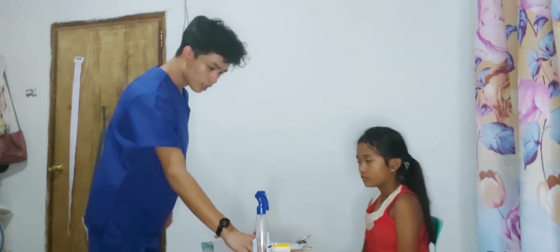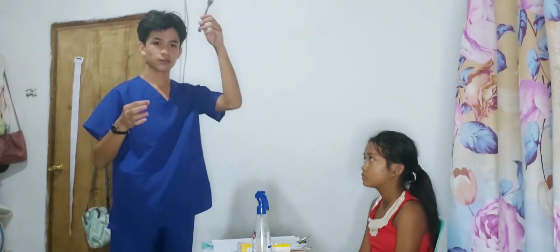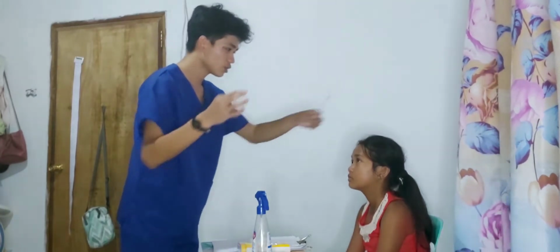So, we are done with assessing the patient with the whisper test. So, next we're going to assess the patient with the Weber test. So, sit properly lang po ma'am. So, using this tuning fork, I'm going to vibrate it. So I'm going to place it to the patient's head. So tell me po ma'am if may naririnig ka pong vibration or na may nafe-feel ka po, okay po? So I'm going to vibrate this tuning fork. Then I'm going to place it to your head.